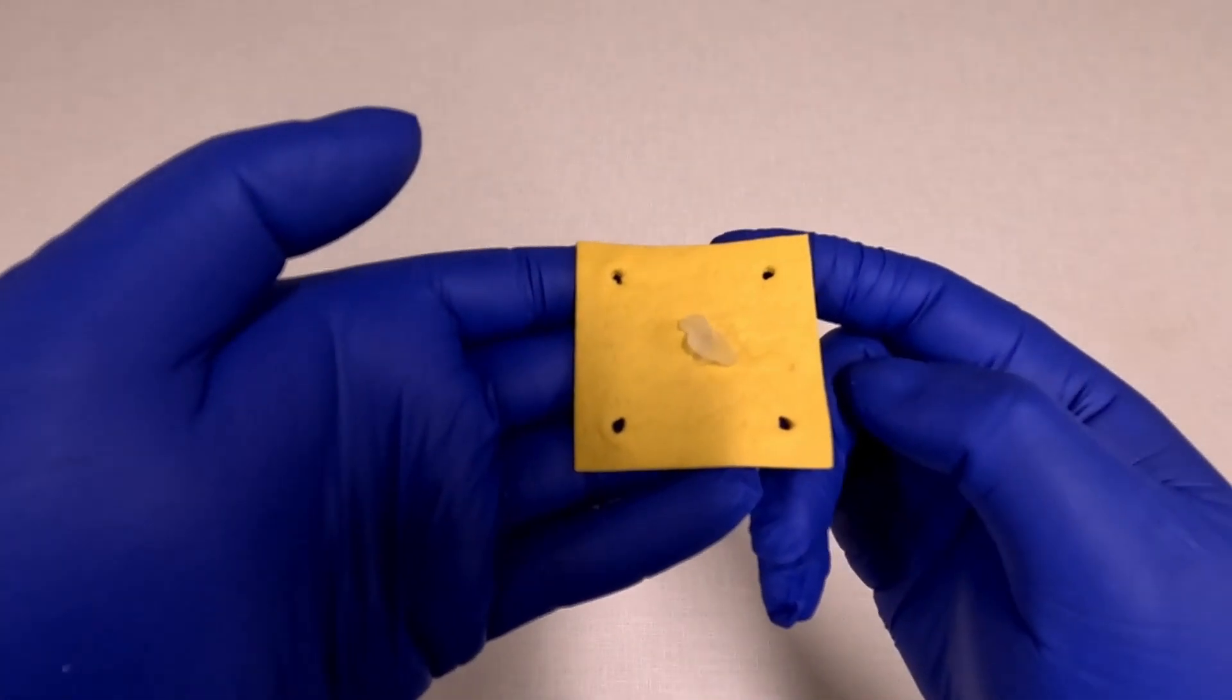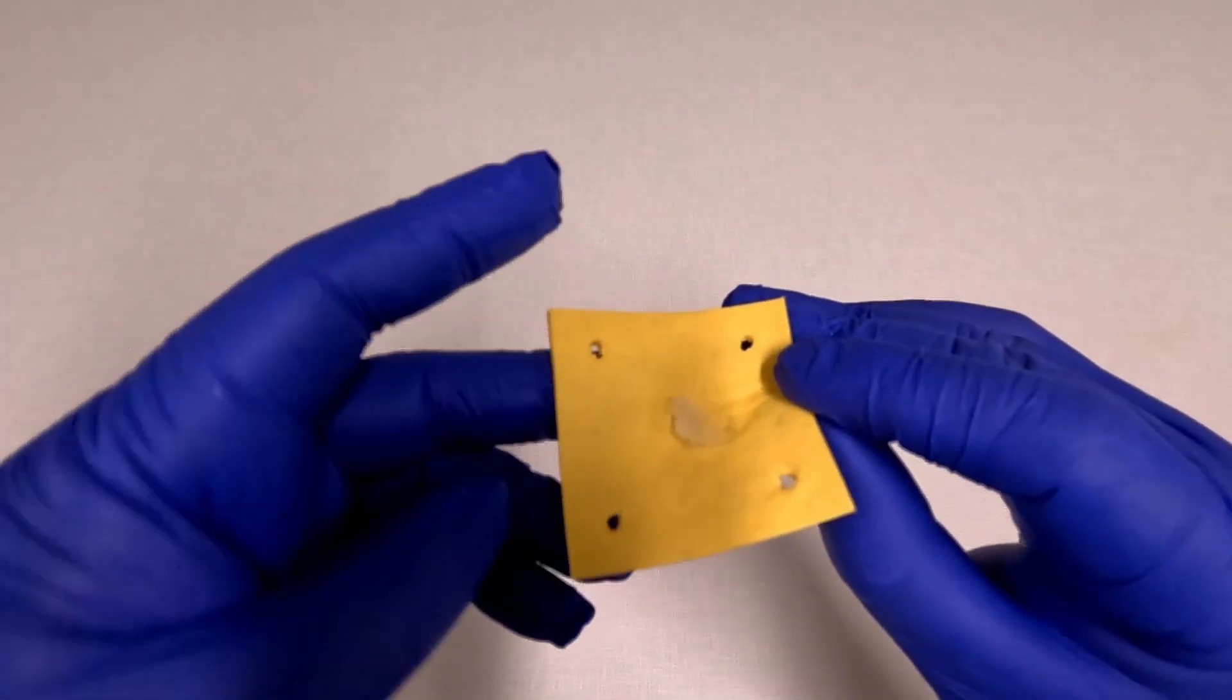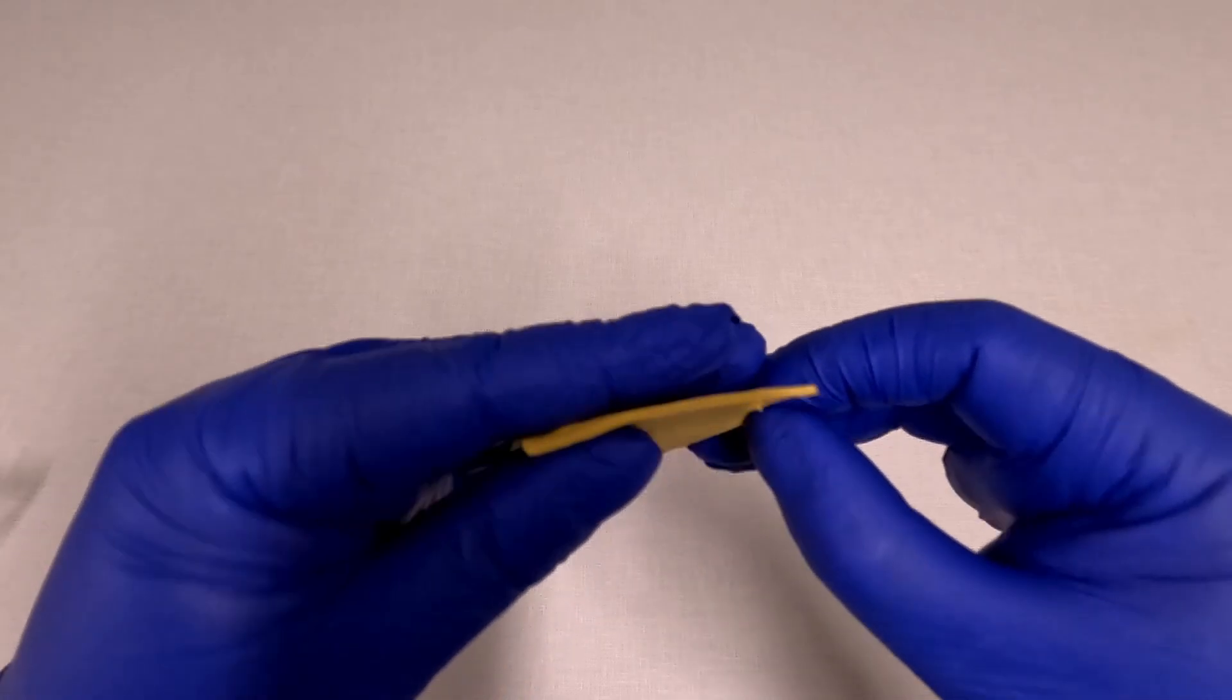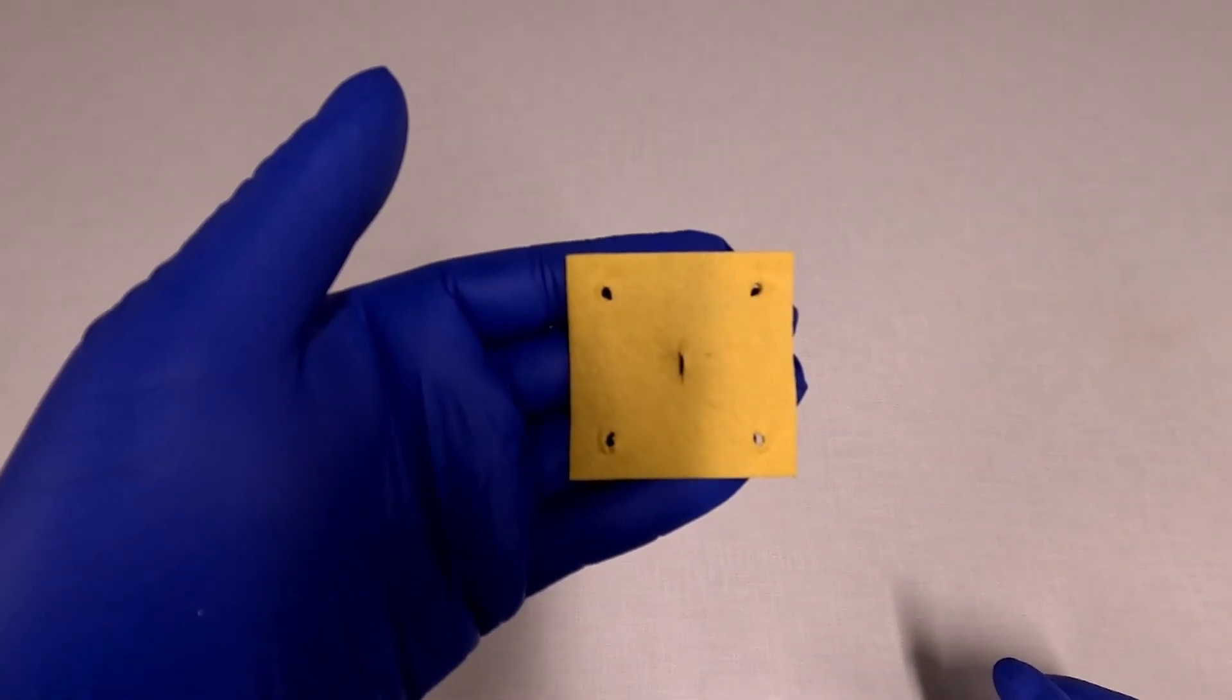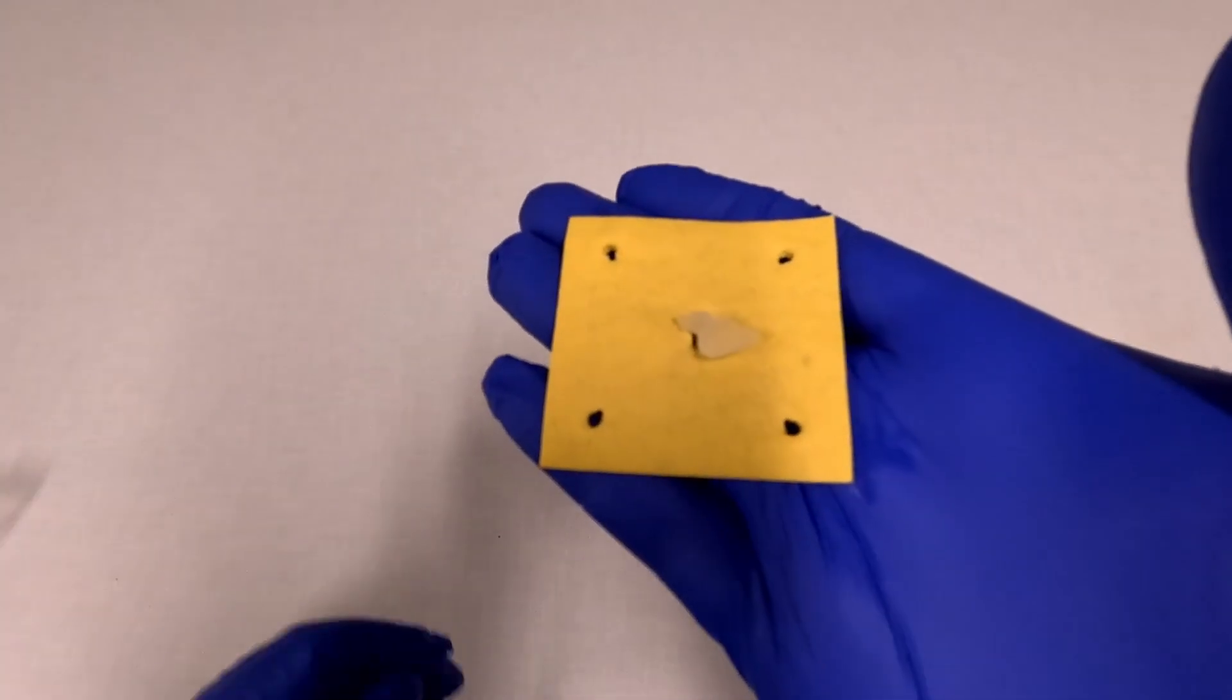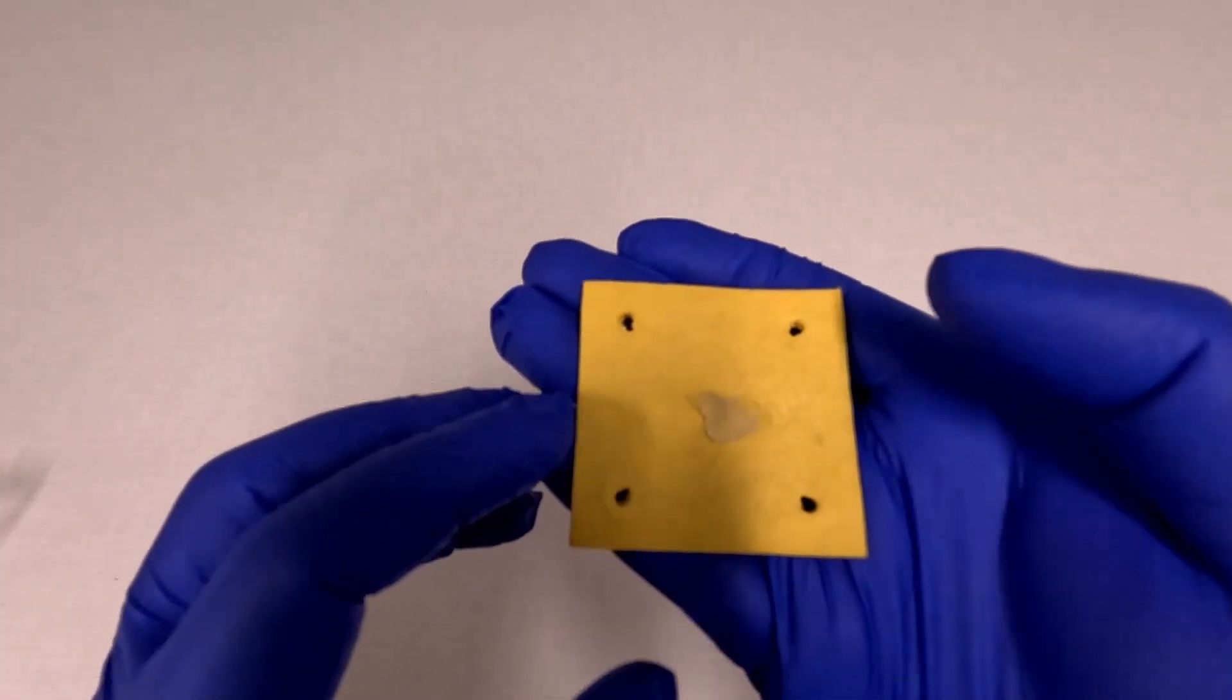Looking at the arteriotomy, we have the polyethylene glycol plug on the outside. And then on the inside, there's nothing because the balloon came out. The polyethylene plug will stay in place for about 30 days and it'll dissolve completely by hydrolysis.